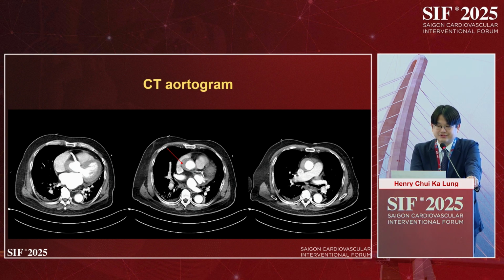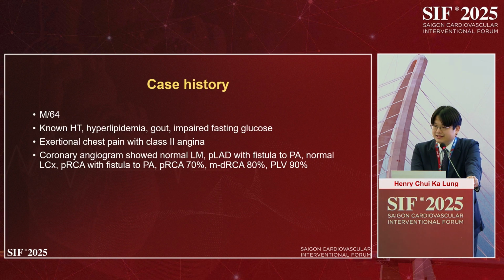So that's why the patient was so ischemic with the ECG showing a left main pattern. The patient deteriorated after the CT and succumbed after that, and we could not do the surgery. But probably the better option would be to stent the left main and then do the CT and ask the surgeon to do the type A dissection repair, rather than sending the patient to the CT.